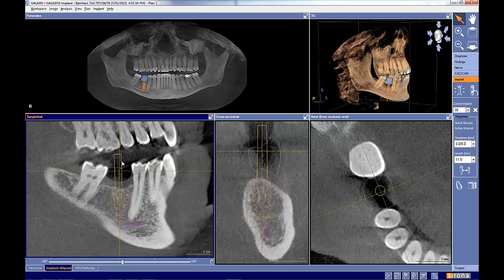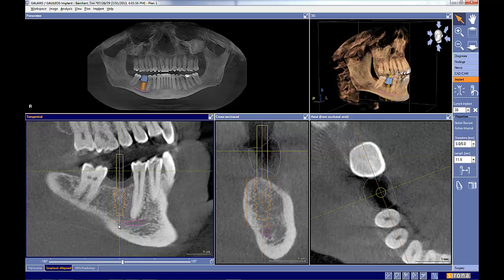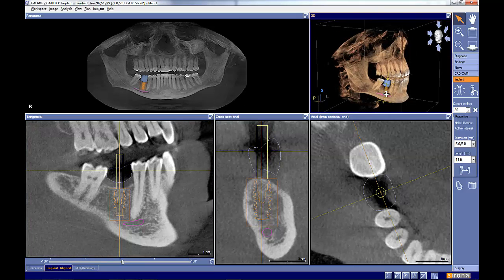Getting the occlusal plane to be perfect is going to be difficult in this particular case. So we will go back with it, and I see why it was done this way. Again, the goal is to test, to see what's going on, and then make that decision.